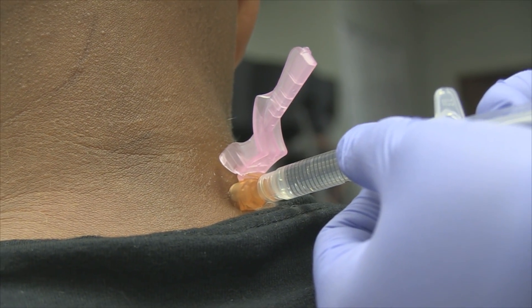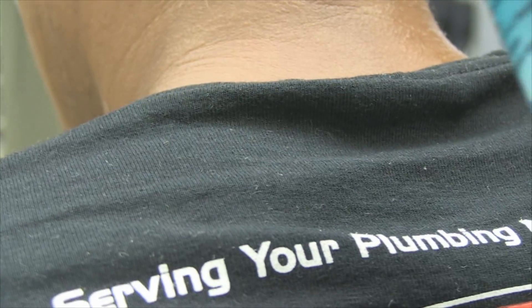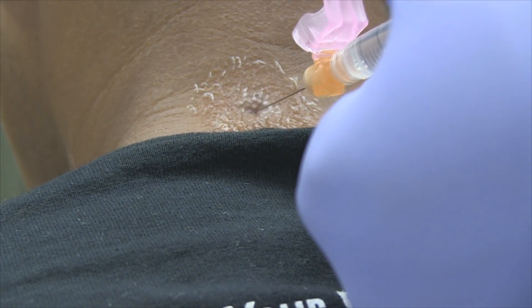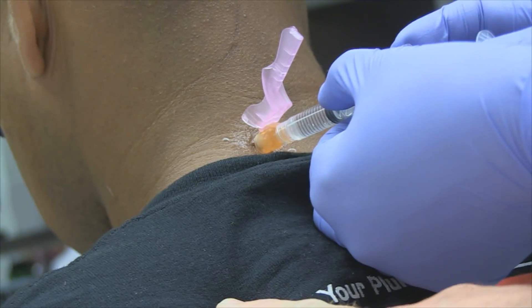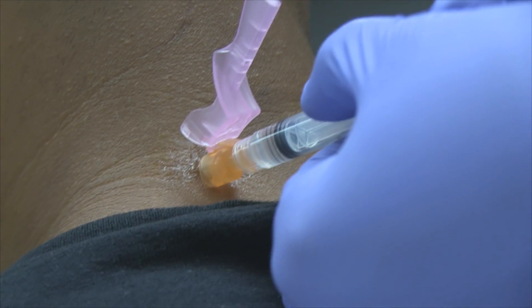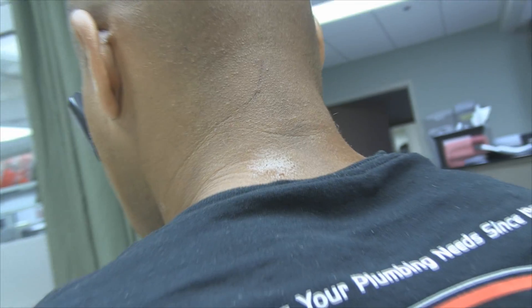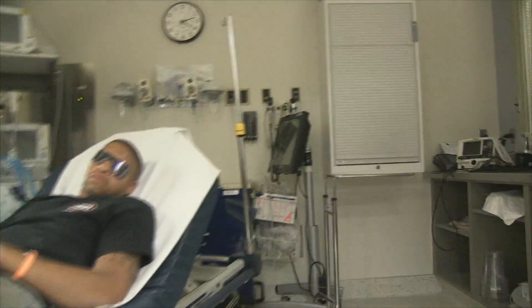Aspirated back — putting in one and a half mL of bupivacaine 0.5% without epinephrine. Spraying the second area. Sometimes I use a distracting pressure with the other hand — just put my finger there and apply a little pressure to confuse the brain.